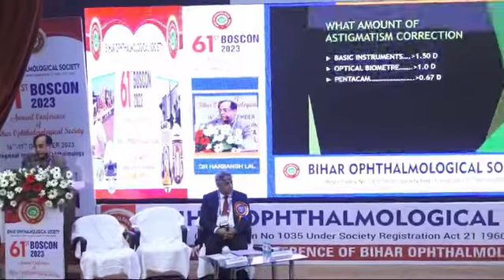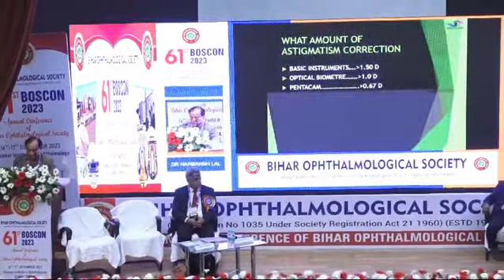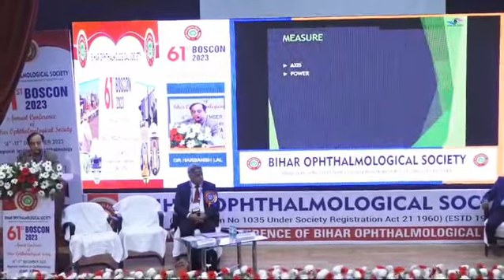Particularly when you are using the multifocal IOL, because now the toricity at the IOL plane is available at 1, which can correct 2/3 of that at the corneal plane, which is 0.67. So depending upon the type of instruments you have and the understanding you have, that should be your target. Initially, when we started, say 20 years back, we were correcting up to 1.5 and above. Then we came down to 1 with the improvement in measurement, and now we can even go up to 0.67, 0.7, 0.8, 0.9.